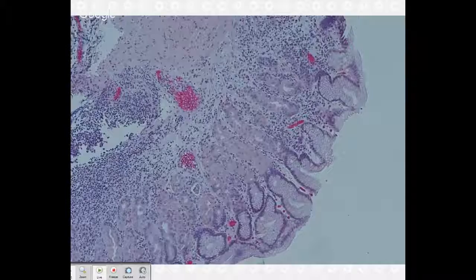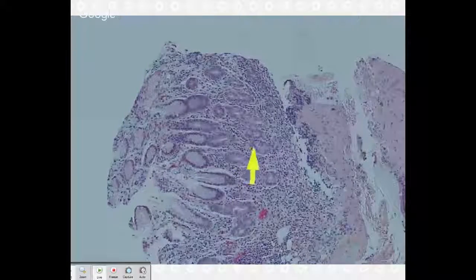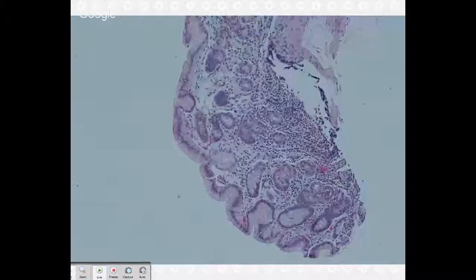Atrophic. And we have an itis, right? Like there's this pretty striking, on low power, mixed inflammatory infiltrate that really is in there. And you really do see that some of the pits just look like they're dying. So not really a true lymphoepithelial lesion, but definitely an itis that is destroying glands.